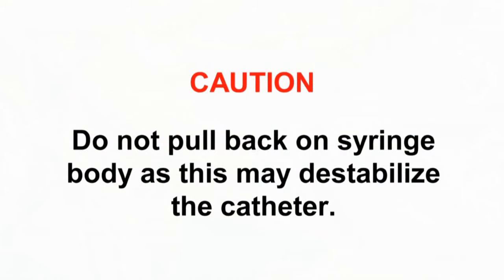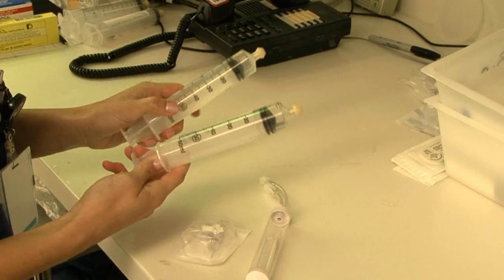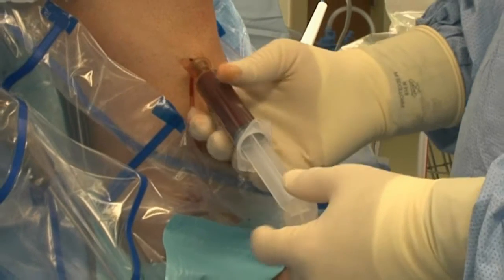Caution: do not pull back on syringe body, as this may destabilize the catheter. Note: each syringe should be preloaded with 5 cc of anticoagulant. Biologic Therapies prefers ACDA.